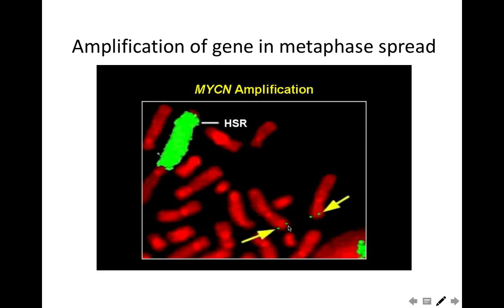You know why? Because a metaphase chromosome is formed of 2 chromatids, right? So this here is one chromosome, but has 2 chromatids. So I see 2 tiny spots, which means a single copy on each chromatid. This metaphase chromosome divides in anaphase. Each of the daughter cells will have just 1 copy of these 2, okay? So this is a normal copy number.